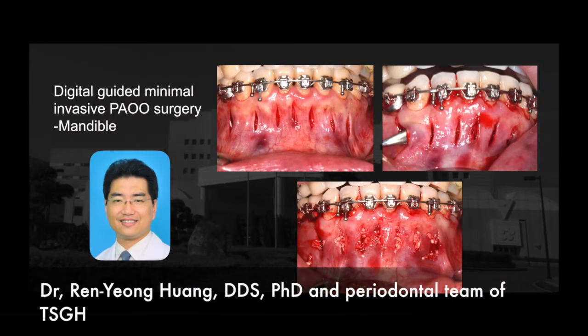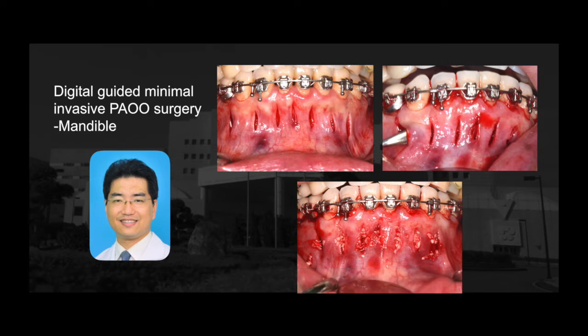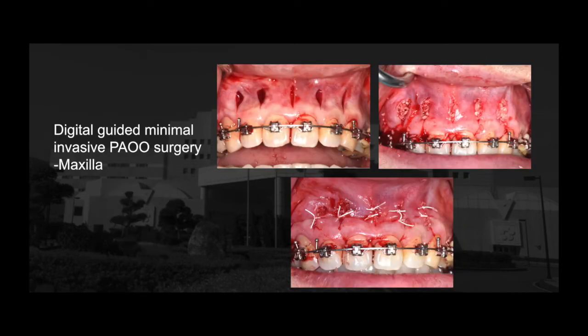After the stability and fitness of the CAPG were confirmed, a full-thickness mucoperiosteal flap vertical incision could be made along the slot of the CAPG to ensure the precision and length of the incision followed the presurgical design. A minimally invasive piezocision procedure was performed using the Piezotome Solo with ultrasonic tips. The internal bone pouches were created for placement of FDBA. Finally, the incision was closed with simple interrupted sutures using Gore-Tex sutures.